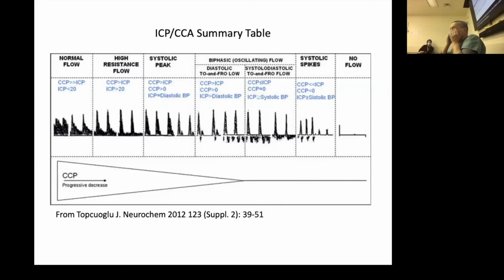It's been a while since I've even studied it, so I think maybe I did it a few times. I'd have to go back and review my approach to actually assessing cerebral autoregulation. But you want to use CO2, and I don't know if you've heard of this, there's a Robin Hood syndrome, or a subclavian steal syndrome. So when you suspect some of those kinds of syndromes, you can make someone hypercapnic or hypocapnic to determine some of your autoregulatory properties. But I haven't formally done it in some time, so sorry.